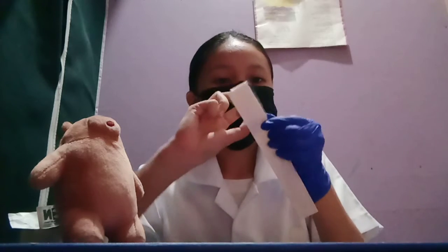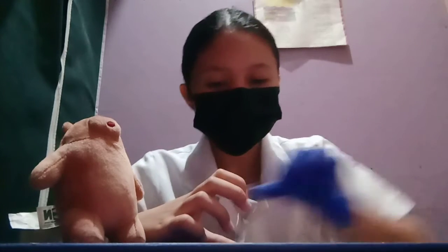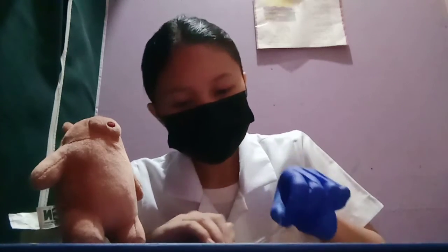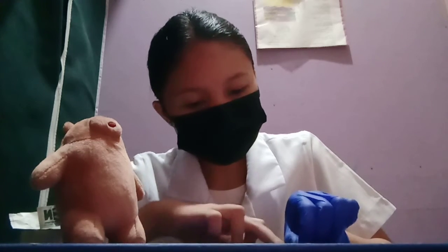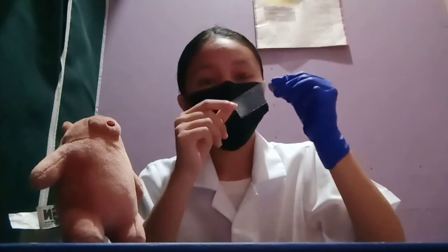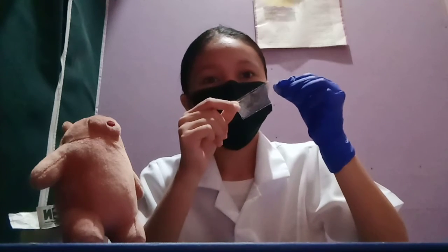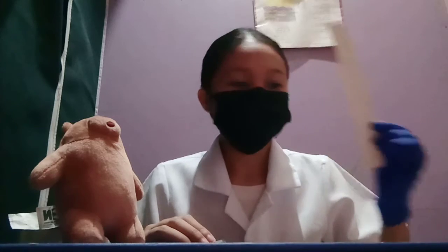Then place the tape back on the slide, sticky side down. Don't forget to dispose of the tongue depressor.